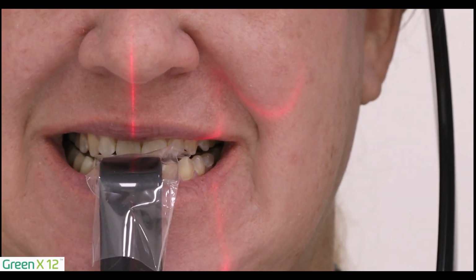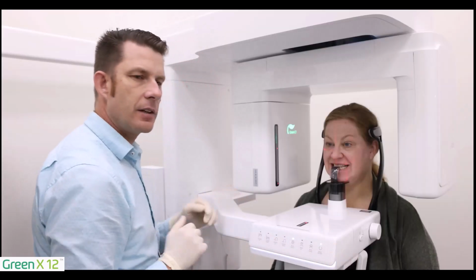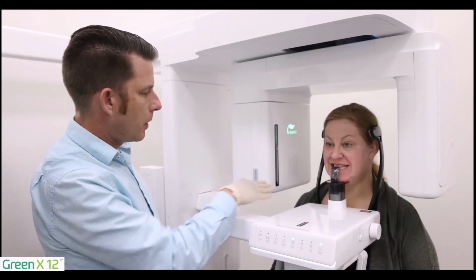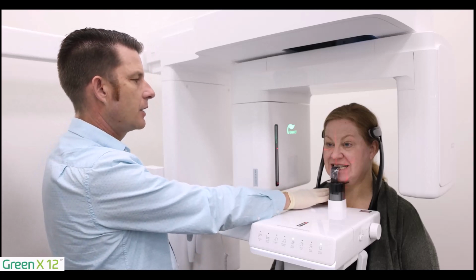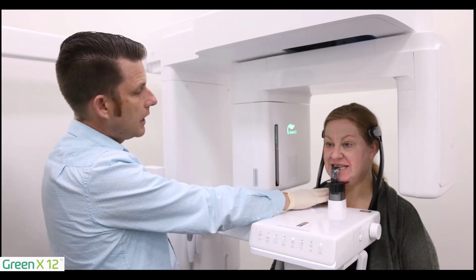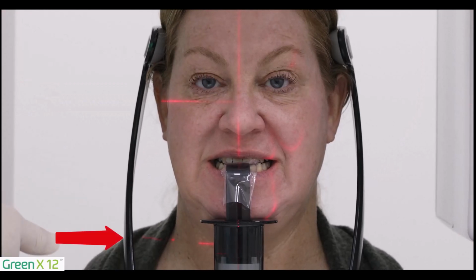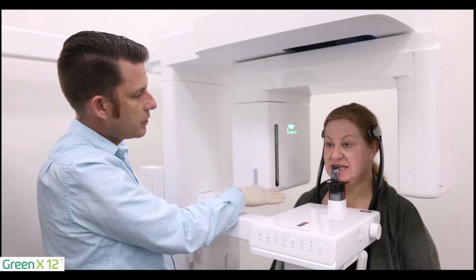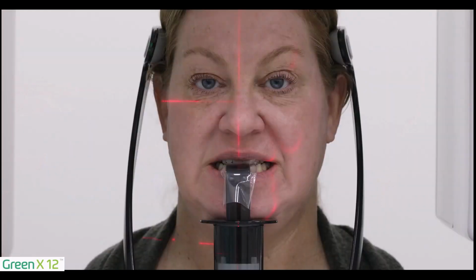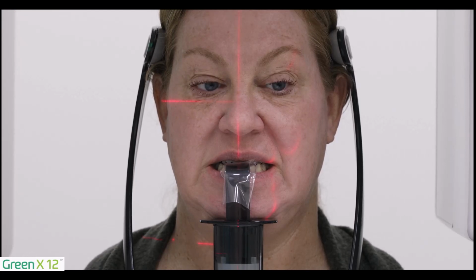Perfect. All right. One other thing to note, on the Green X platform, off of the X-ray tube head, there is also another beam that shines. This denotes the rotation of the device. If this beam is hitting the patient's shoulders, we may have to work with the patient for patient positioning, but as you can see here, it's at the base of the neck, and that just allows us to estimate the rotation of the device, ensuring the device will not hit the patient's head.